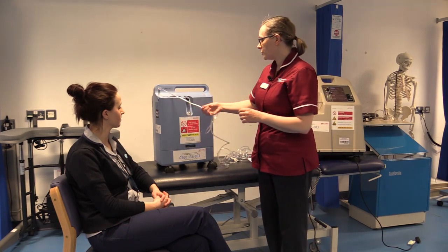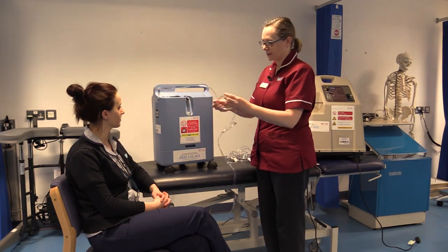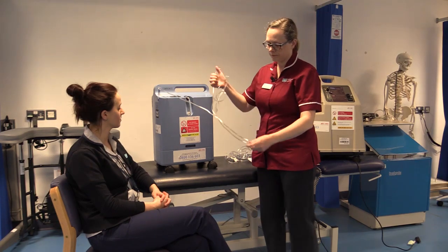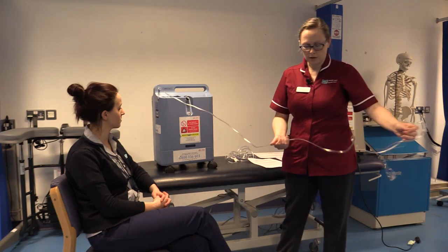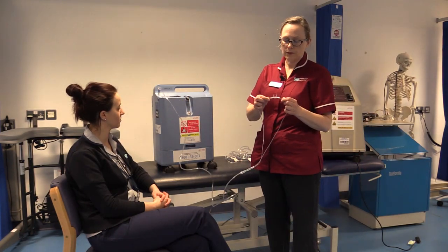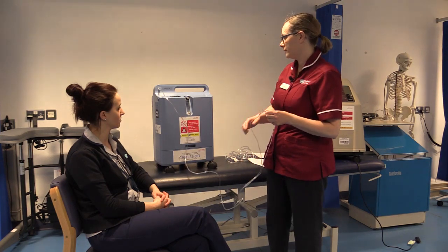When you're about to use it, you must ensure the tubing is not kinked. So you unkink your tubing and ensure it is clean. We look at the nasal cannula. Are they clean? If they're not, we will wipe them with a damp cloth.